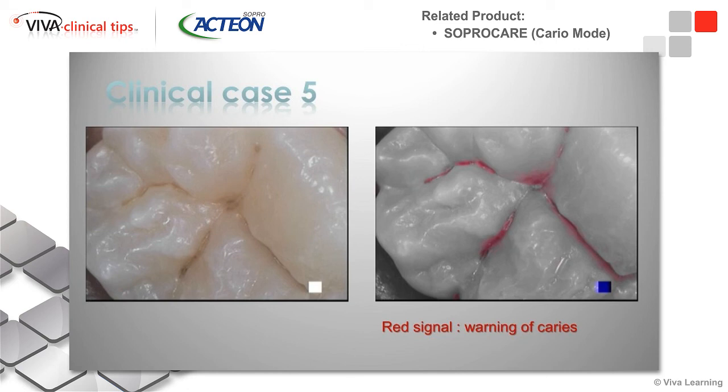And I have another practice where I work, and we have a lot of elderly patients, and finances make them kind of restrict their x-ray exposure, and sometimes even health-wise, people are going through chemotherapy and things like that. And again, this is my world, what I experienced, and this actually just happened this week too. And when they have something that they don't want an x-ray for, at least I can get my doctor a picture with the intraoral camera and putting it on the caries mode.